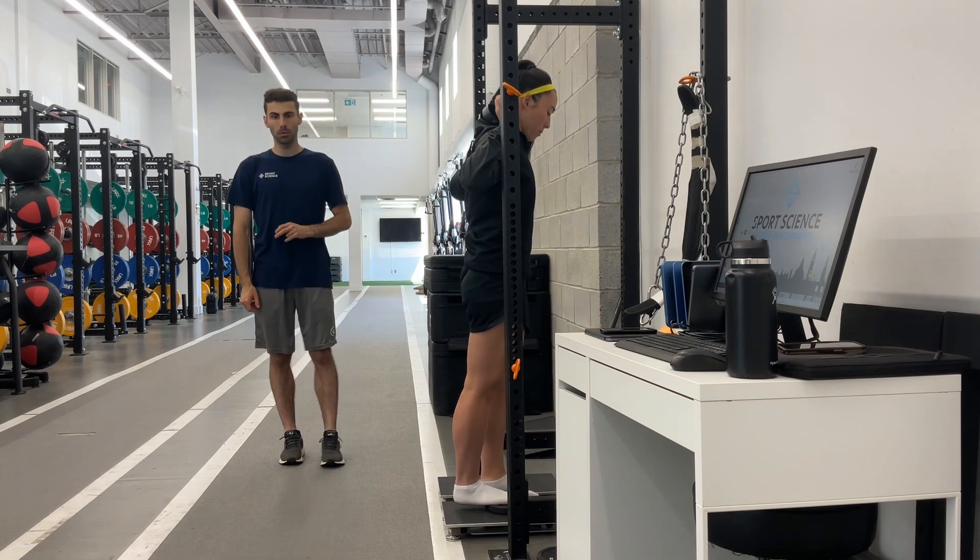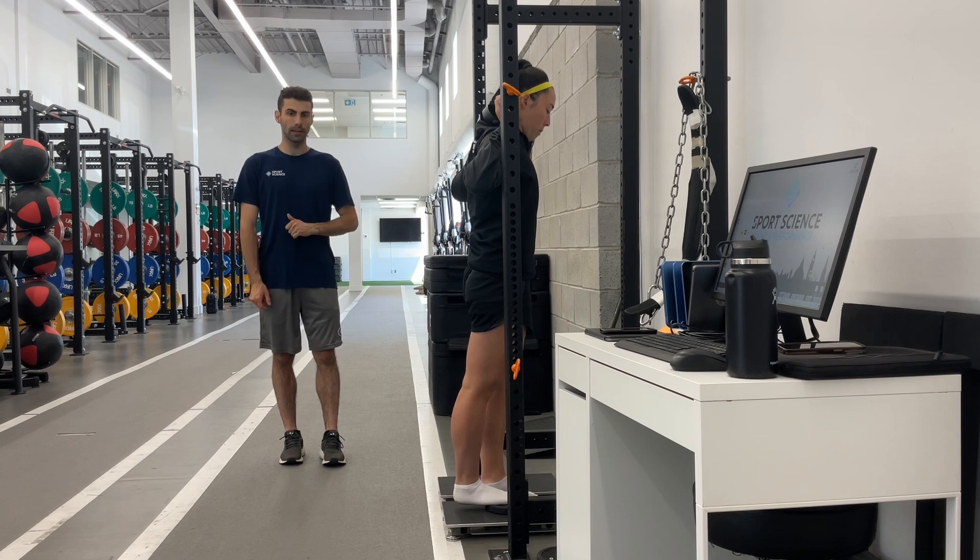For this test, we want to complete two reps for max force with a three to five second push, and then two reps for max RFD where the focus is on zero to one hundred percent.